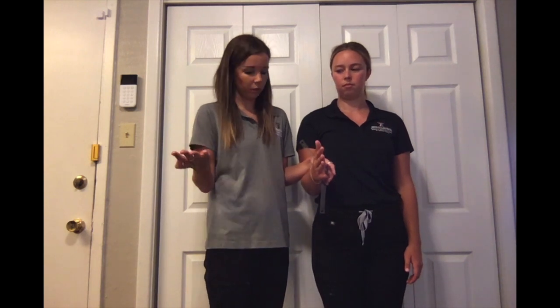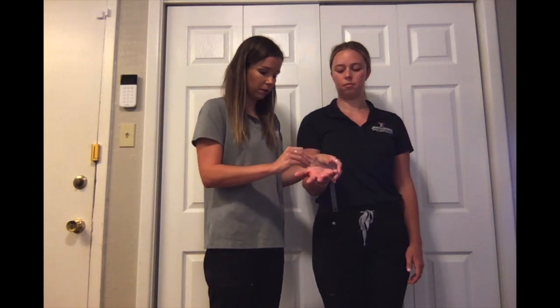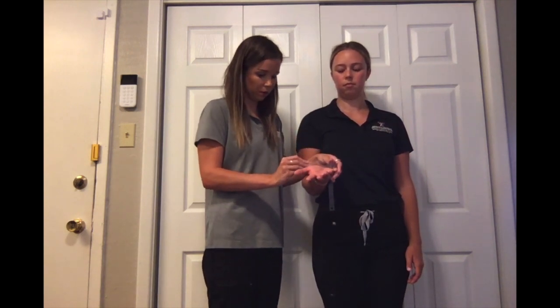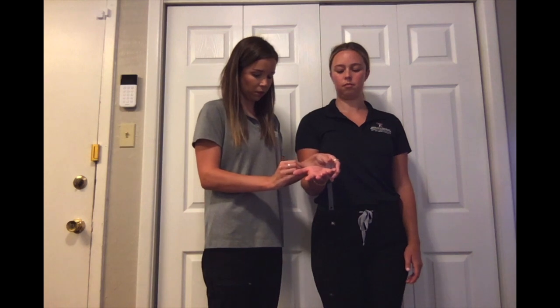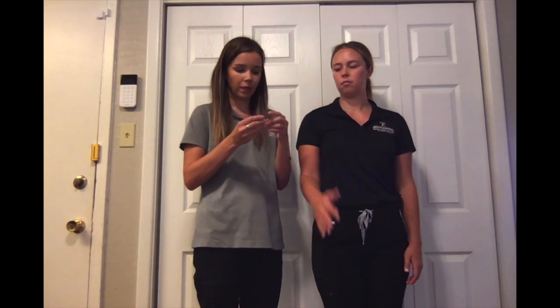Addison, I want you to flip your palm up for me. Addison has 85 degrees of forearm supination. The normal range of motion for forearm supination is 80 to 90 degrees.